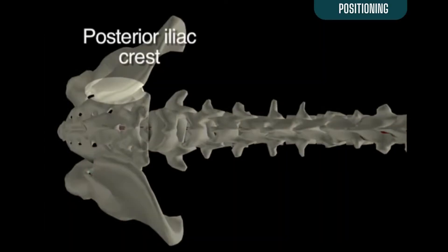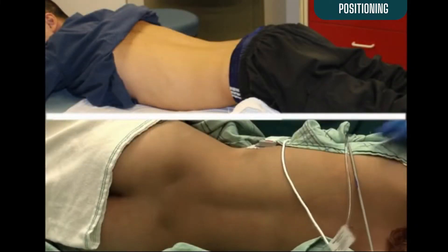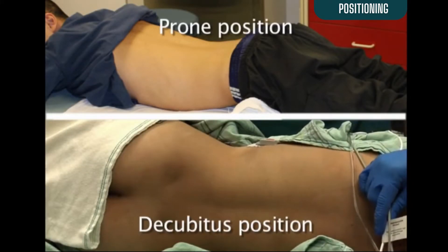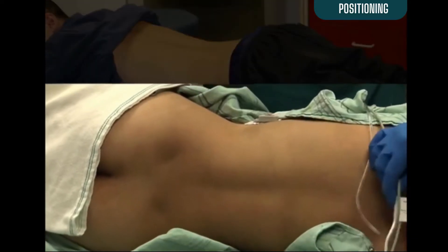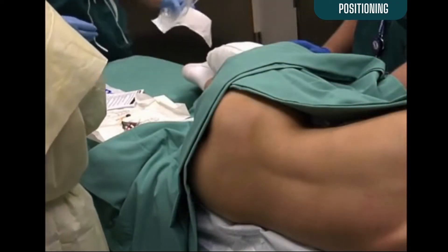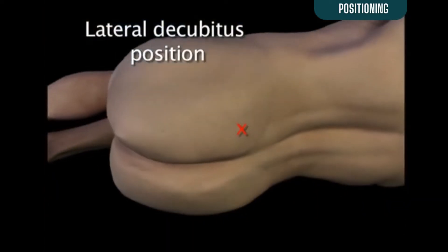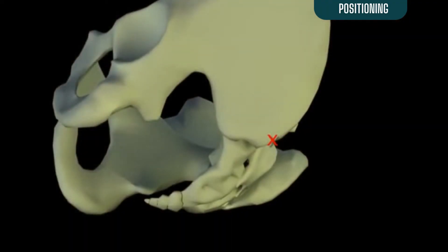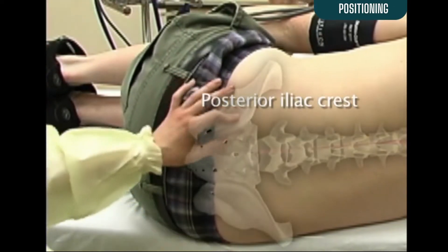The posterior iliac crest is the most common site used to obtain bone marrow. This site can be reached with the patient in either the prone or decubitus position. This video will demonstrate the decubitus position. The patient should be positioned in the right or left lateral decubitus position with knees flexed. The posterior iliac crest is located at the center of the posterior superior iliac spine. With the patient lying on his or her side, palpate the posterior iliac crest.